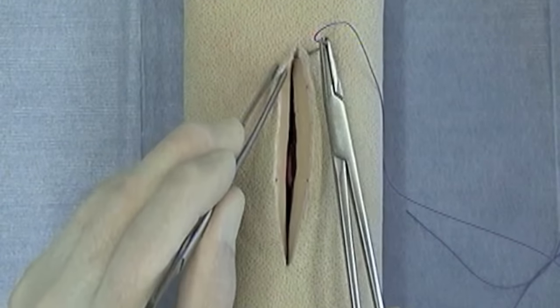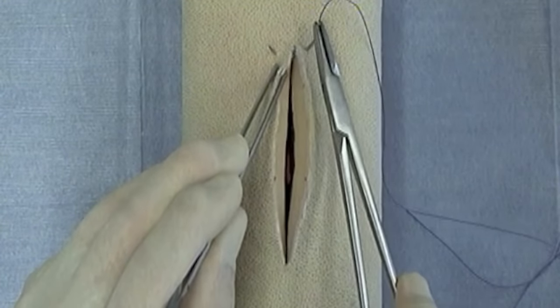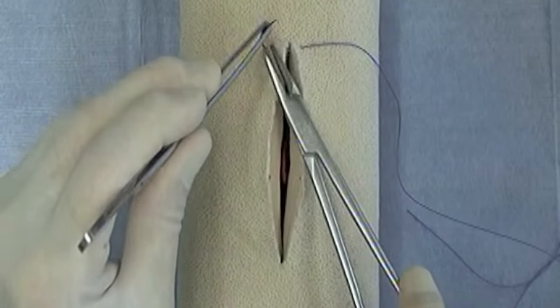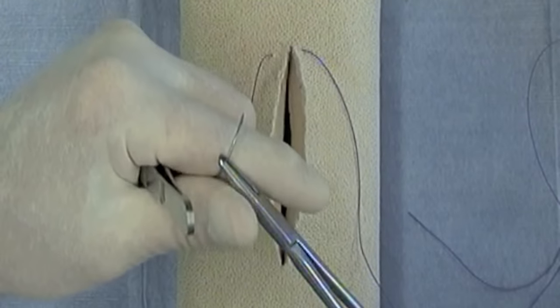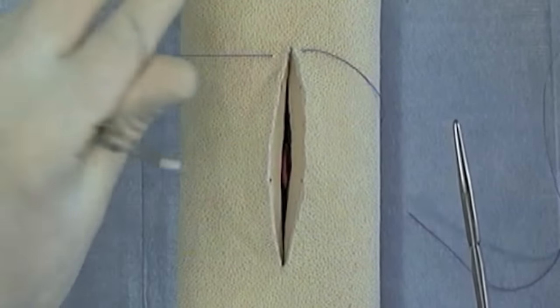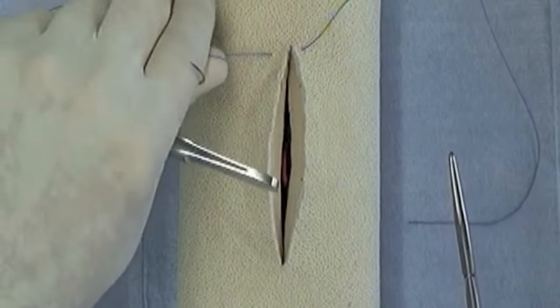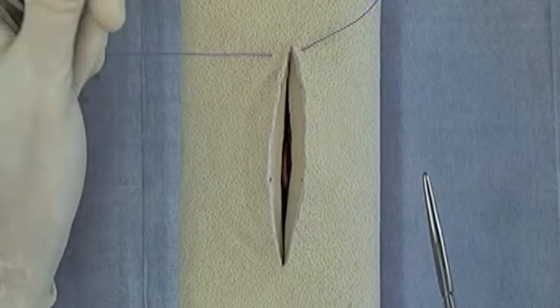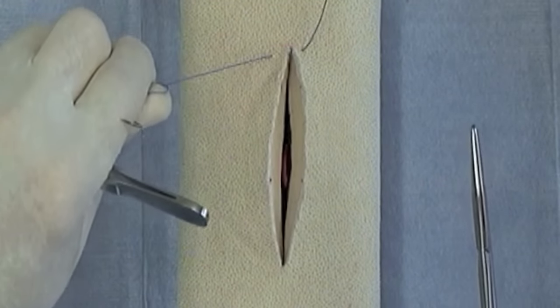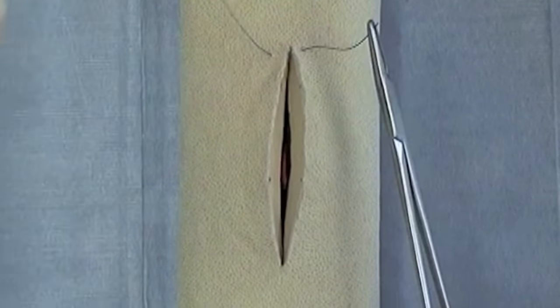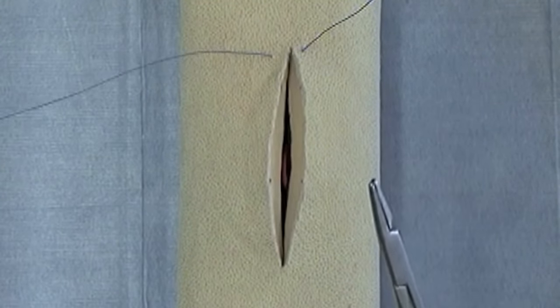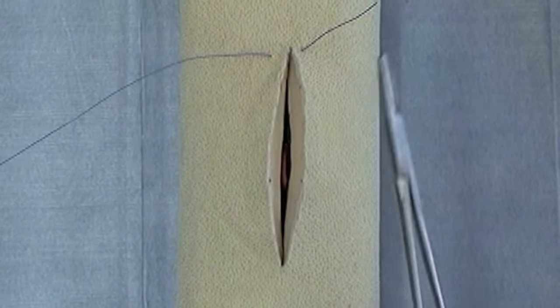Full thickness bite, full thickness bite. Notice I'm tucking away the needle and using a technique to gather suture. Gathering suture is something that you should learn throughout this course. It's a good technique to maintain control of your suture in an orderly fashion.